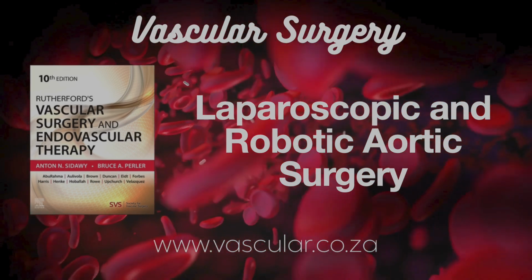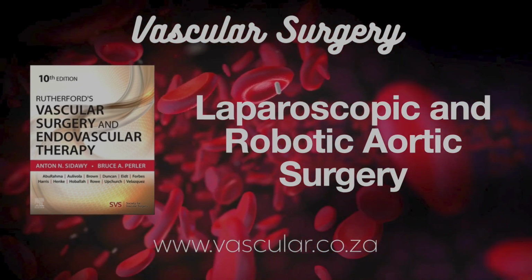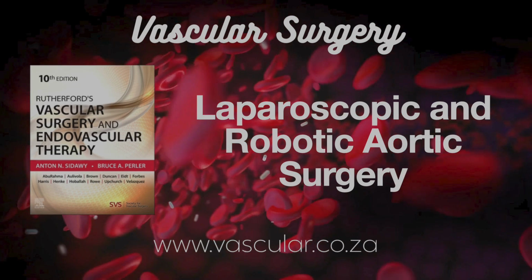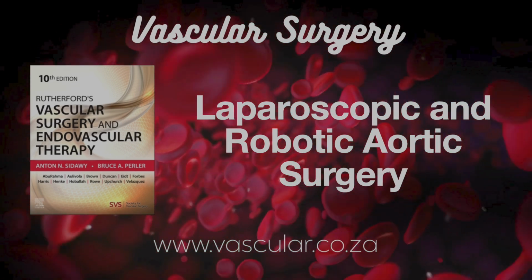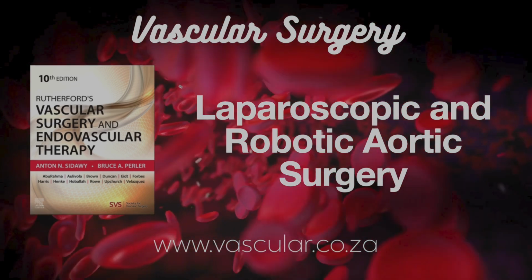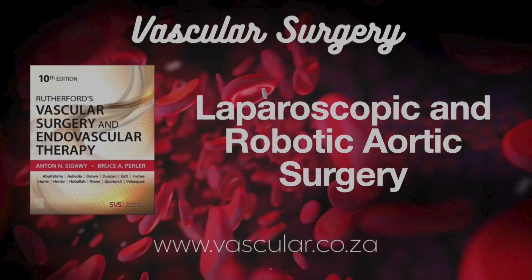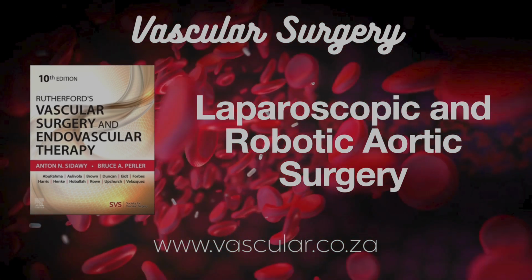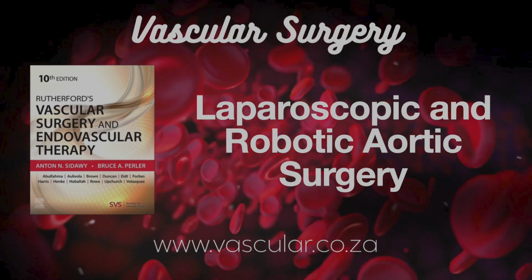Yes, there was one comparative study highlighted. It found that the actual sewing time, the anastomosis time, was shorter with the robot. Ah, so the robot was faster for the tricky bit. For that specific part, yes. But, and this is the catch, the total procedure time was actually longer with the robot. Longer overall. Why? Because of the setup time. Getting the robot positioned, docked, ready to go, that adds time up front. So faster sewing, but longer overall case time in that study.